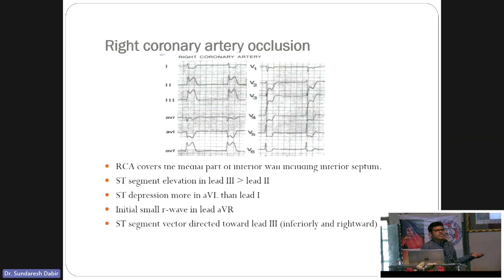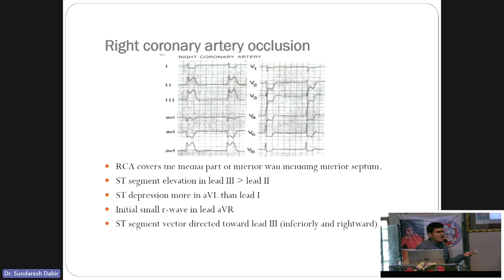To differentiate proximal from distal RCA: look at lead V1. If V1 is elevated or normal but with significant depression in V2, it is probably proximal RCA. If there is depression in V1, it is likely distal RCA. The most specific method is to do the RV leads. The most important lead is RV4.